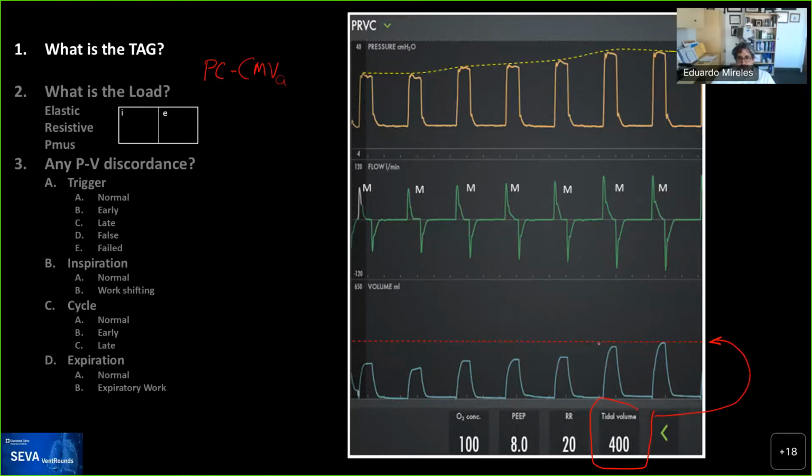Yeah, so if the patient, for example, here got a pneumothorax or a mucus plug, or somebody sat on their chest, or you laid them flat and they have a huge belly, the tidal volume will go down, and then the machine will start going up on the pressure. So there may not be any alarm that will come out as this is happening if you're not majorly out of range.